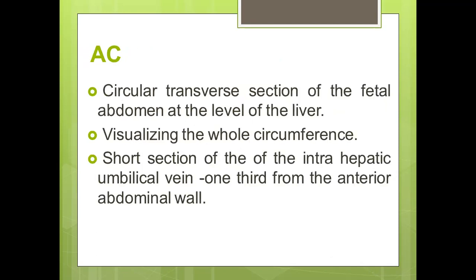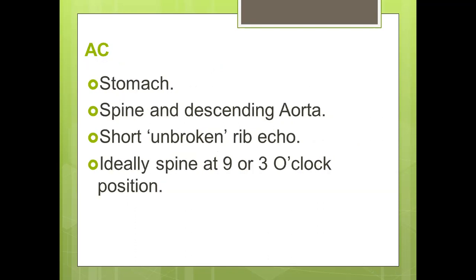Abdominal circumference seems to be the most difficult parameter to measure, but with care and accuracy we can get a good result. Key points: the transverse section of the fetal abdomen should be circular, not oval or oblong. The whole circumference should be visualized with a short section of the intrahepatic umbilical vein. We should visualize the stomach, spine, descending aorta, and a short unbroken rib echo. Importantly, the spine should be at nine or three o'clock, not at twelve or six o'clock, because spine shadowing can obscure other structures.